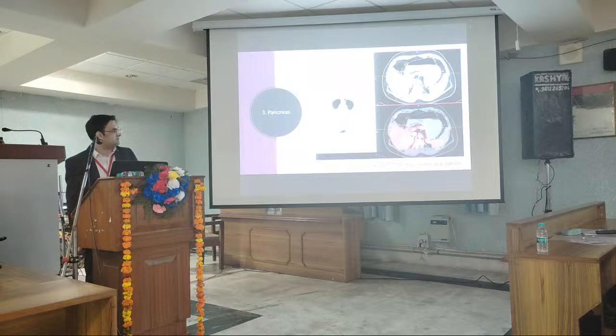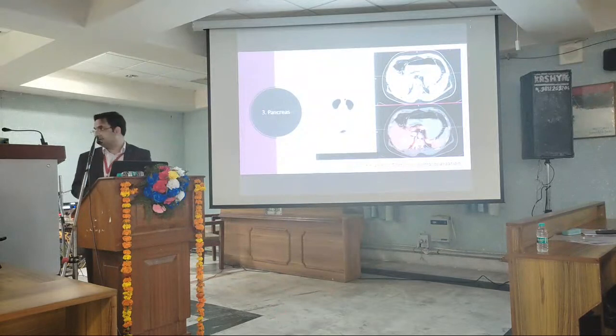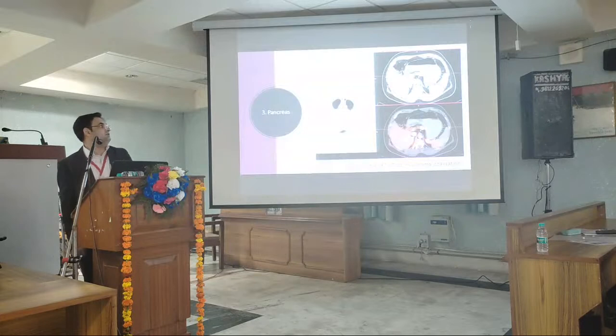If we go by the focal uptake and look retrospectively, what I can see even on plain and contrast CT is probably the pancreatic tissue, and there is subtle nodularity. So there is a very high chance of missing these findings on plain CT. Probably first we have to have a relook radiological assessment, and then maybe we can add on this modality. A lot of times, what I'm trying to say is that an experienced radiologist on a relook can really help.